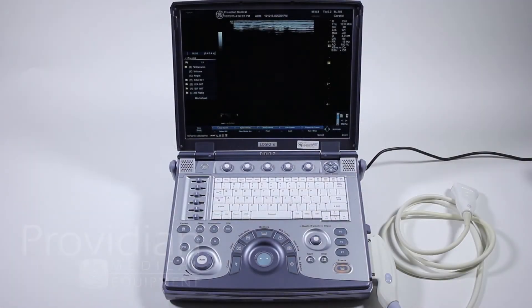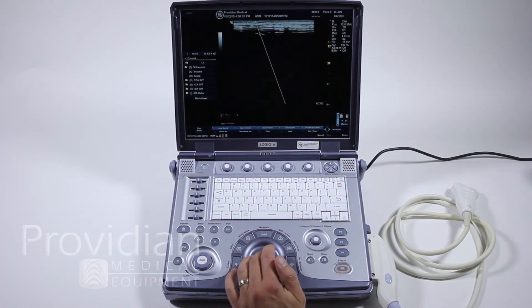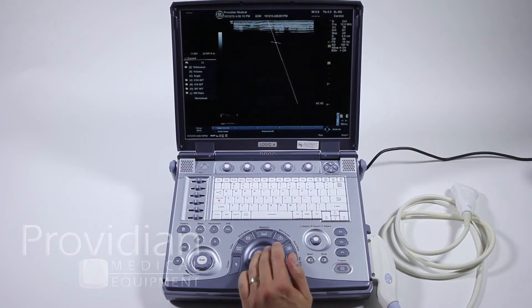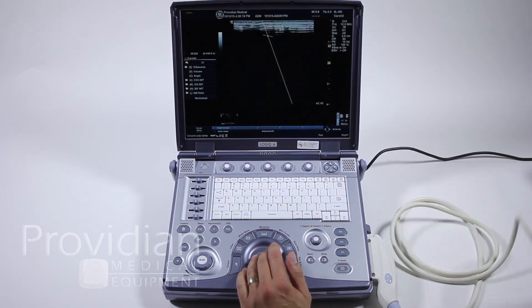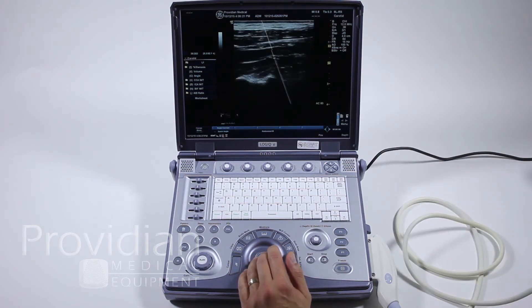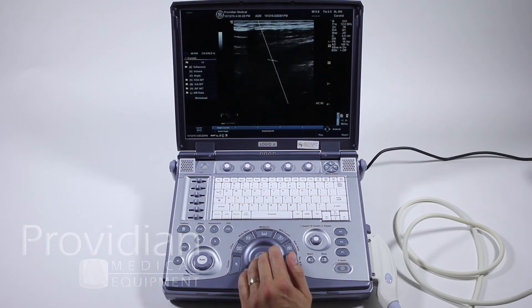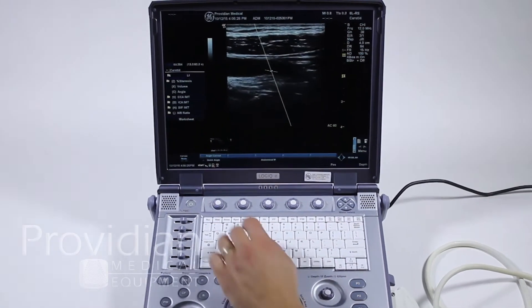For Doppler and M modes, the first thing you'll want to do typically is to press the MD cursor. Make sure you're in a live image so you can scroll it around, and here you can move it to wherever you'd like to move the cursor before you get into Doppler mode. This allows you to see a better 2D image before you do that.